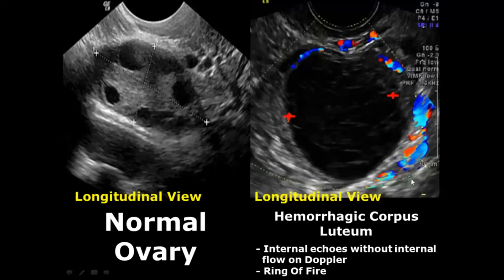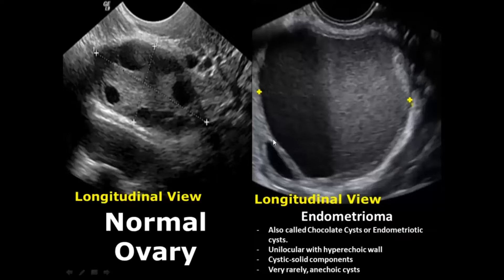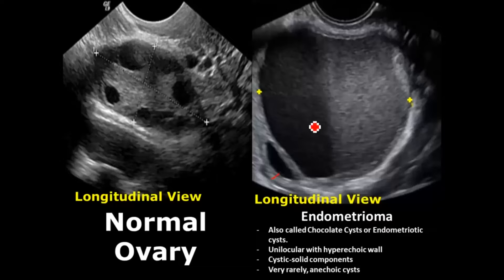A hemorrhagic corpus luteum shows peripheral vascularity — the ring of fire — and internal echoes due to blood products. Endometriomas, also known as chocolate cysts, have a unilocular appearance with thick walls, internal echoes giving a ground glass appearance, and cystic-solid components. The cystic component is slightly lower in echogenicity and the solid component is slightly higher in echogenicity.